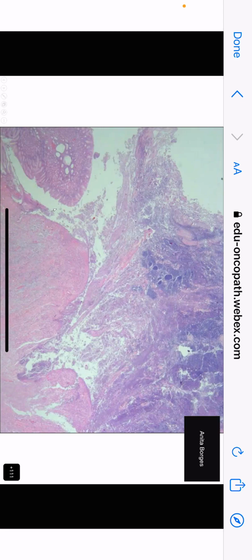Ma'am, there are diffuse... I can see this one is the muscularis mucosa in the middle portion, and above that there is diffuse infiltration by mononuclear inflammatory cells, and there are also some bluish areas in the upper portion. I mean, all of this, you can actually make out something? You can make out something, Dia? That you can see inflammatory cells and all that?